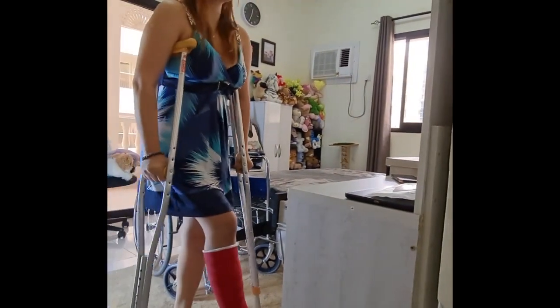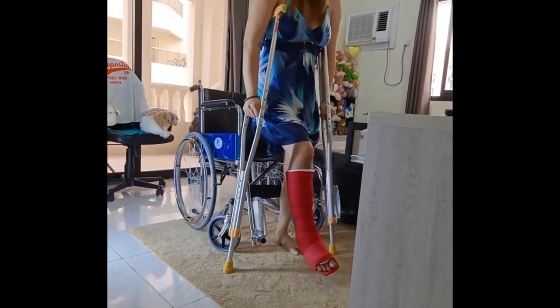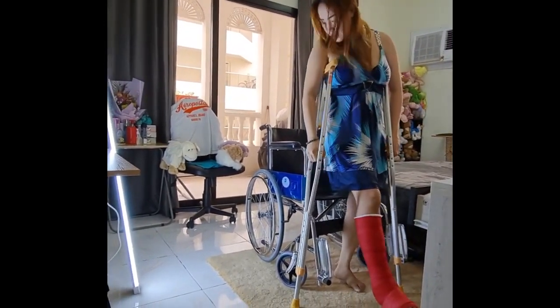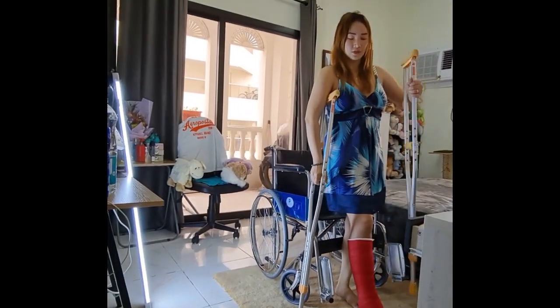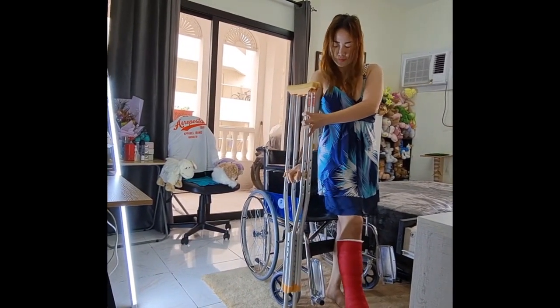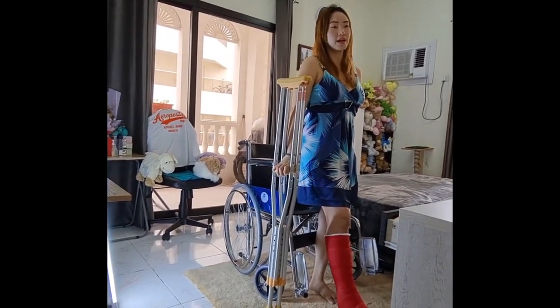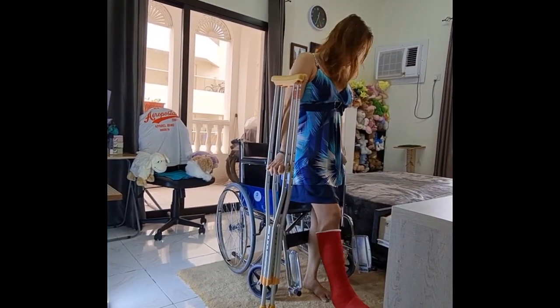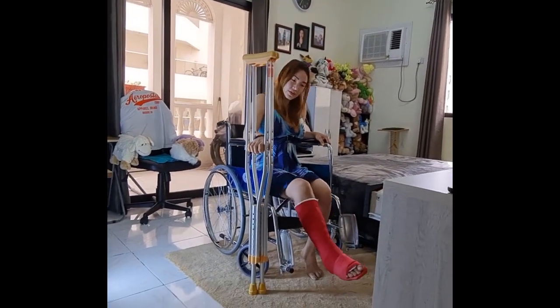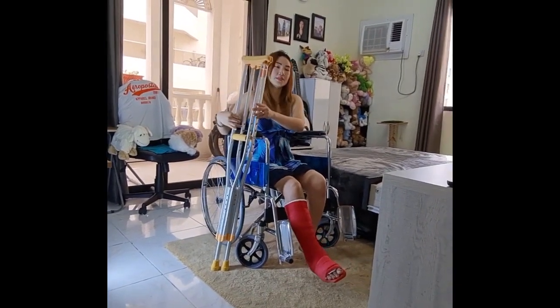When sitting down, make sure you are close to the surface — whether it's a wheelchair or bed. Transfer the crutch to the side, then place your other hand on the opposite armrest or surface, and sit down slowly. You can also do it like that.